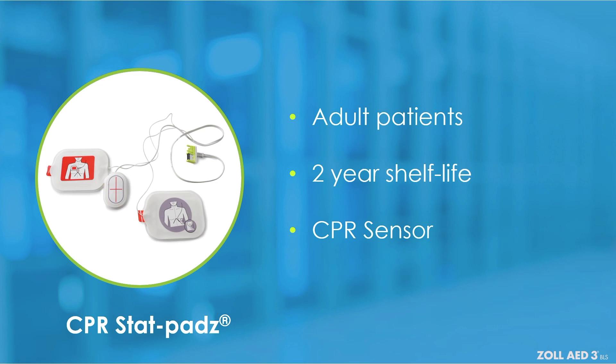The Zoll AED-3BLS uses this data to provide feedback to the rescuer on CPR rate and depth through voice prompts, text prompts, and in real-time numerically on the CPR dashboard display.